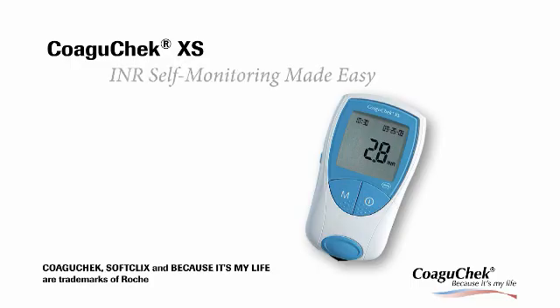CoaguCheck XS. INR self-monitoring made easy.